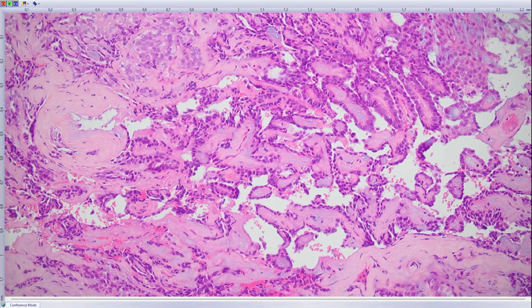So the main message is, when you see this tumor, look for metastatic foci, usually in neck lymph nodes, and inform the clinician that they should be irradiated. They are very radiosensitive. So they have similar properties to papillary carcinoma of the thyroid, which is very often mistaken for it.